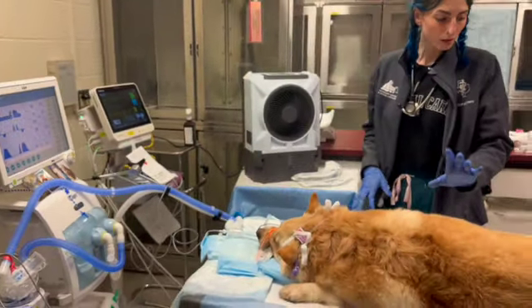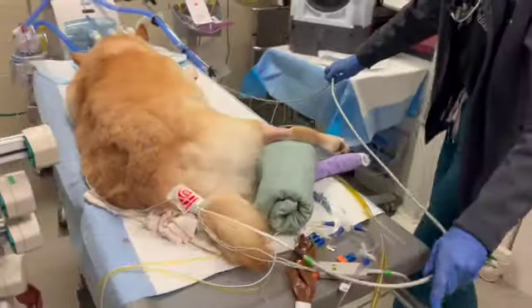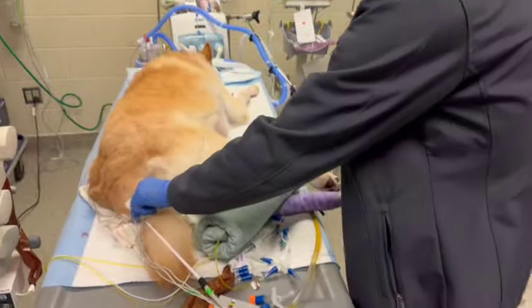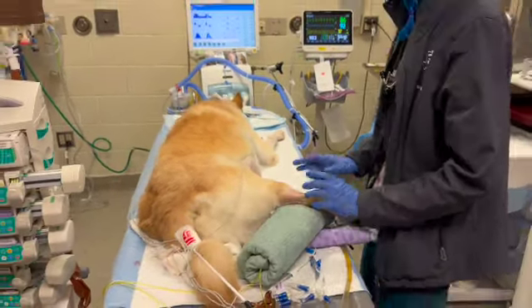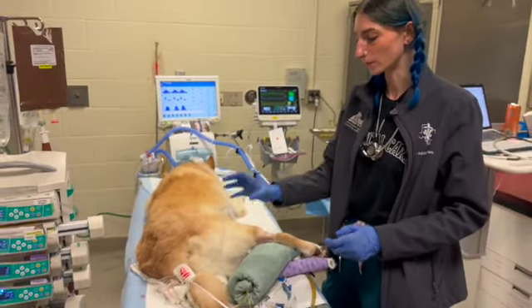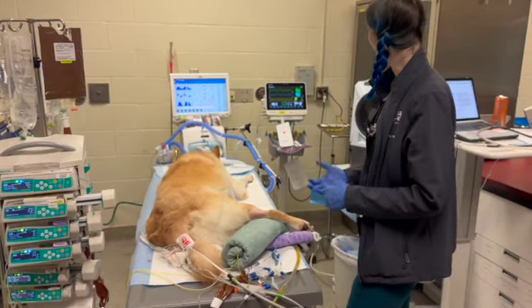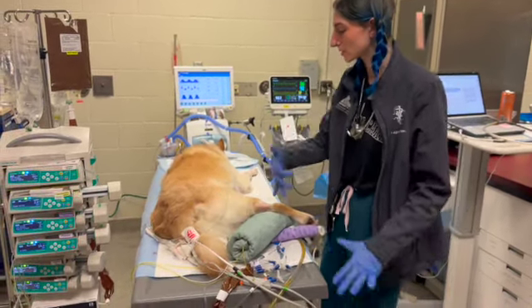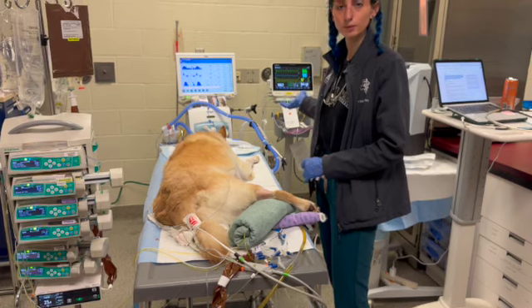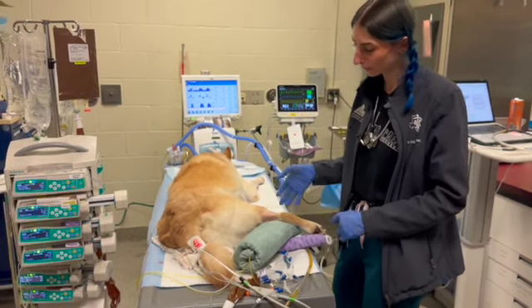And then moving along, we have our blood pressure cuff that is connected to the machine. We currently have it on this patient's tail just because all of the limbs have been poked and some of the limbs have some peripheral edema. So we figured that would be the best area for his blood pressure cuff. And this is non-invasive. There are ways to do invasive blood pressure on him, but unfortunately we just were not able to access that at the time.